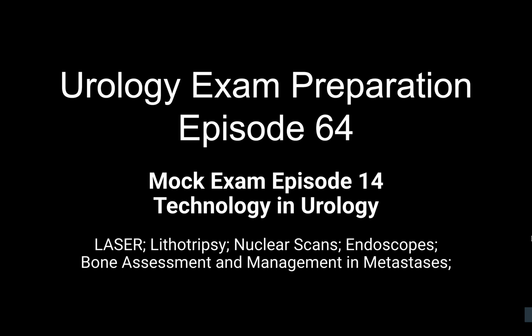What is the difference from the technology point of view between the sterilizable, reusable flexible cystoscope which we use in general and these single-use scopes? What is the difference in technology? The single-use scopes are digital scopes, while the reusable flexible cystoscopes are fiber optic scopes. With the digital scope, the chip is at the tip of the scope, and it transmits the image to the monitor, which has better quality compared to the fiber optic scopes.